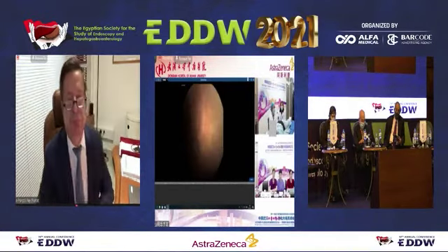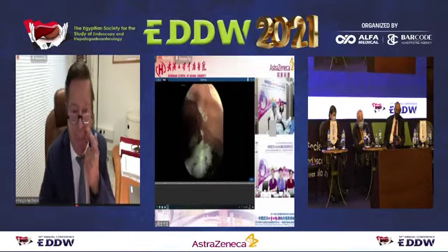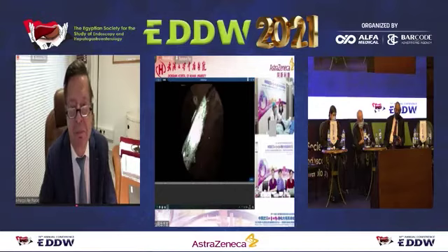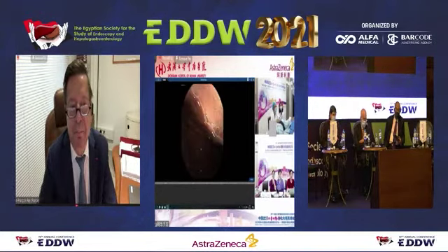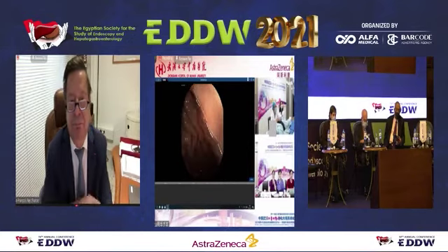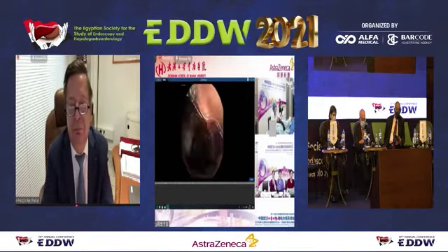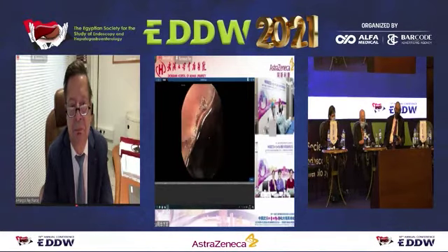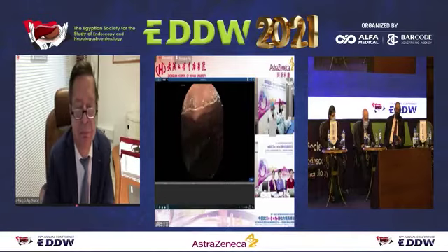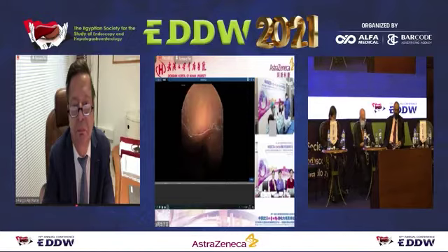Okay, could you show us now the antrum and pylorus? Show what? The antrum and the pylorus. Antrum and pylorus, we will show it. Okay, we can go to the gastric antrum. They want to see the antrum, pylorus, and the angle. We can go down now. Can you see the angle?